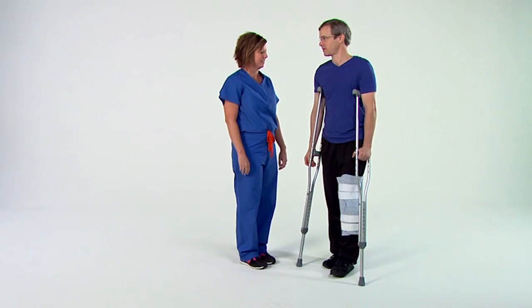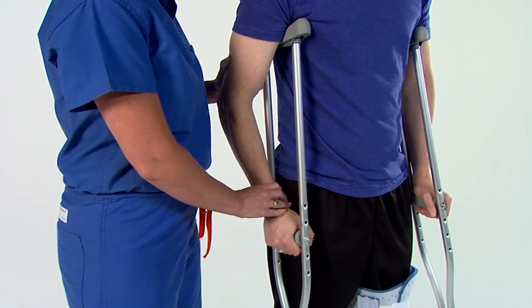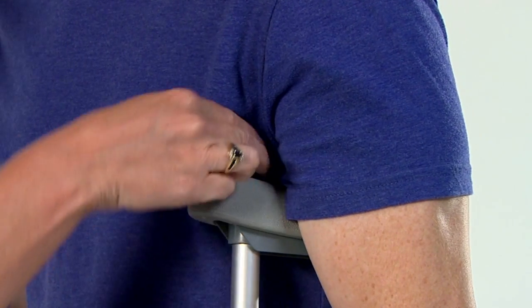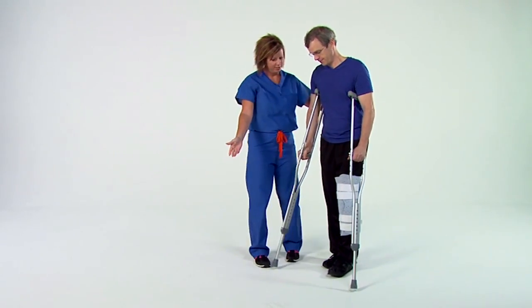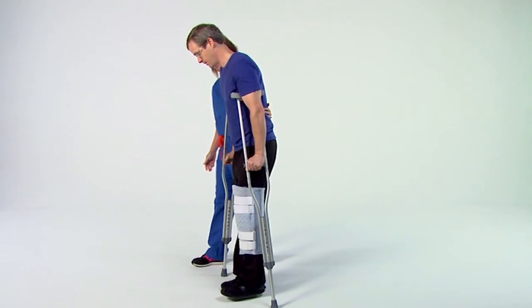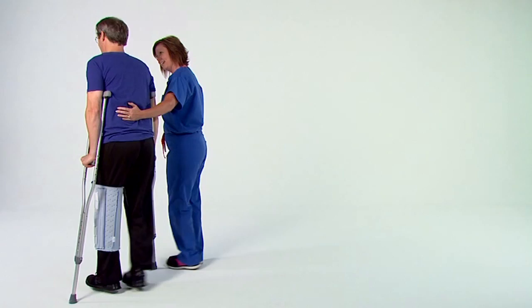Your crutches should be shoulder-width apart and your elbows slightly bent. Make sure the crutch pad isn't pushing into your armpit. There should be about two finger widths distance between the pad and underneath your arm. As you begin to walk, bring your crutches forward. Then push through your hands and advance your non-surgical leg, stepping with the opposite leg.